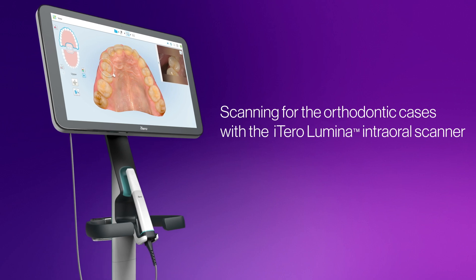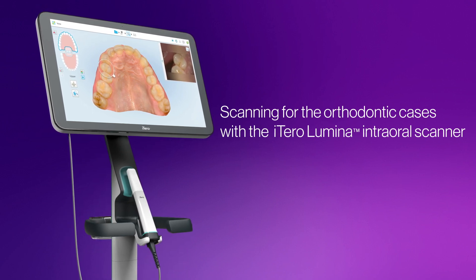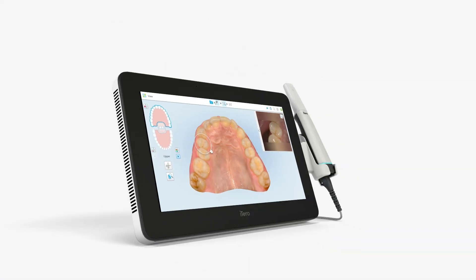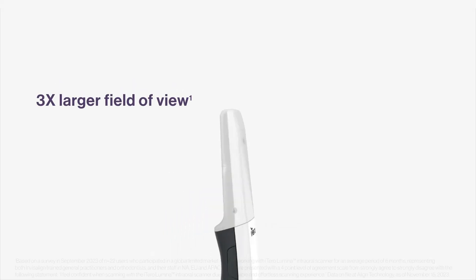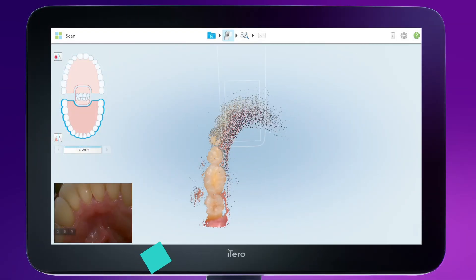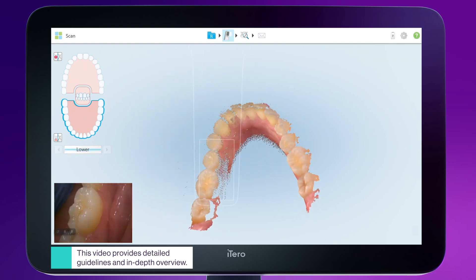This video covers the full orthodontic scan with the iTero Lumina scanner, including best practices for scanning certain dental conditions. Scanning with the iTero Lumina scanner offers a flexible, uninterrupted scanning experience. The larger field of view and greater capture distance allow faster anatomy capture and improve patient comfort. This scanning path demonstrates the best way to effectively capture the entire anatomy.